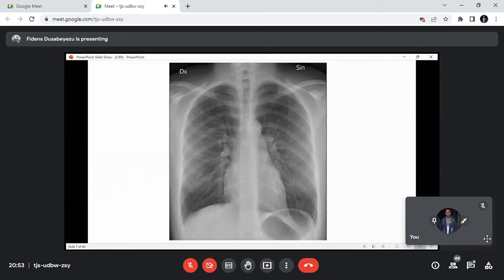Angulation normally does not exist when you are doing a PA in radiology because the machine is set, the X-ray beam is normally perpendicular to the body of the patient, to the chest. But in ICU, when they have used a mobile machine, they have moved an X-ray machine from radiology to ICU, for example, that perpendicularity will no longer be there. And when it is no longer there, there is no symmetry.